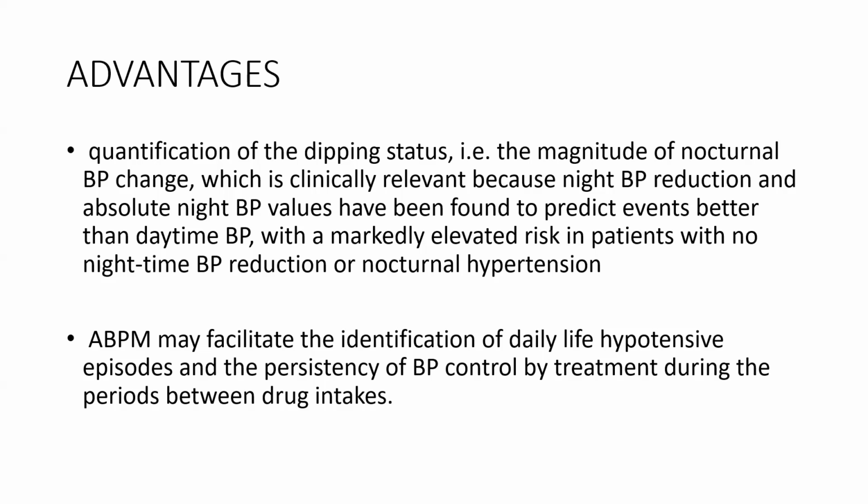Ambulatory blood pressure measurements may also facilitate identification of daily life hypotensive episodes and also help to know whether the patient is on target in between medications.